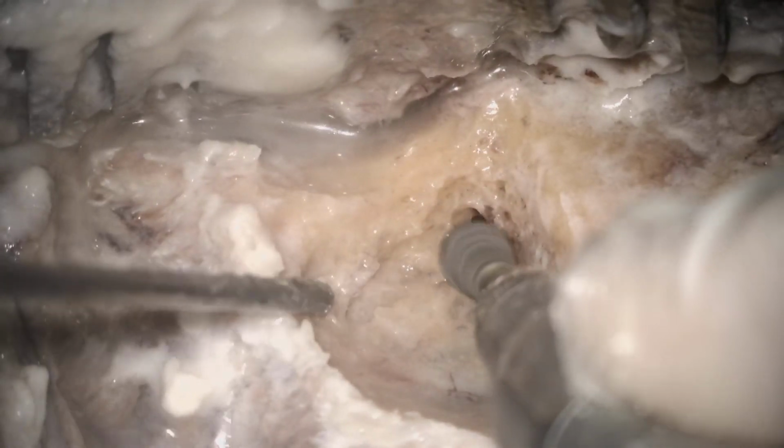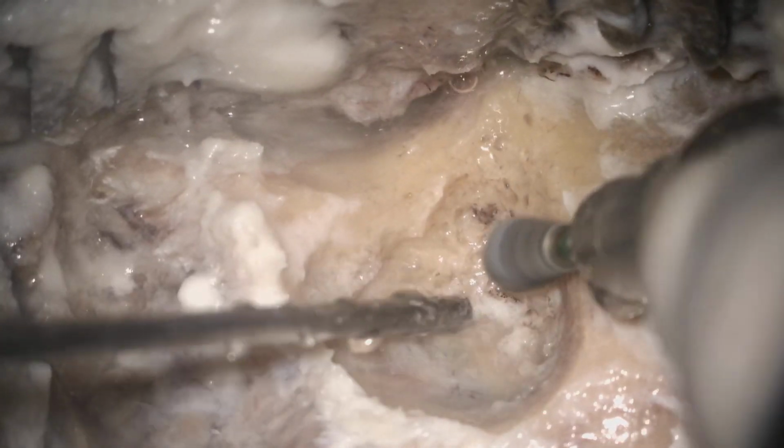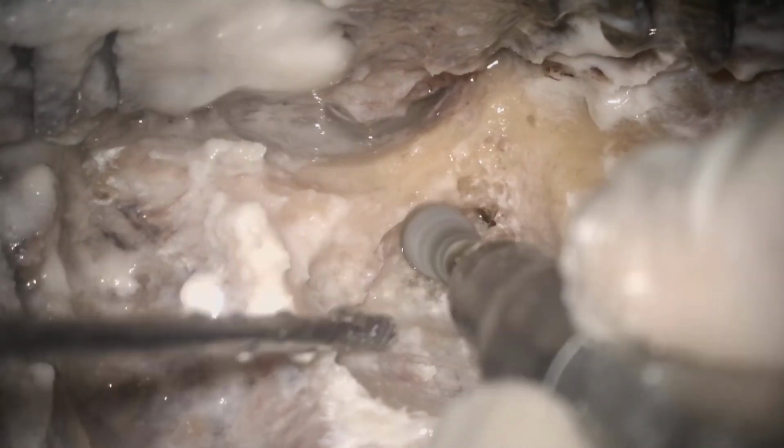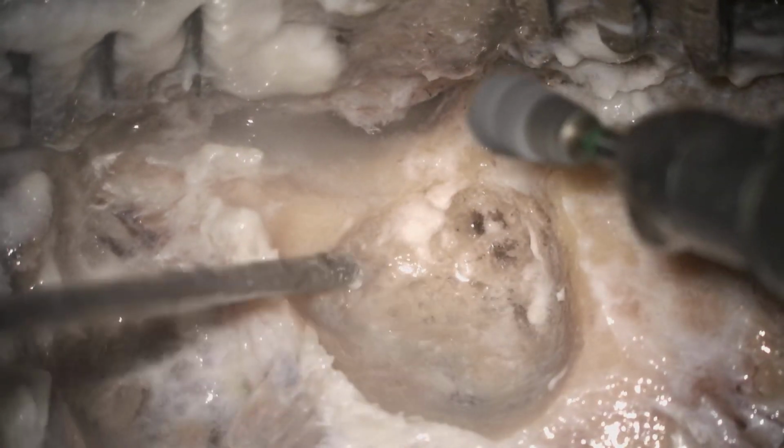So in that regard, temporal bone dissection, delineating all the anatomical structures, is definitely more difficult than a live surgery, because in live surgery there will be bleeding, there will be sentinel bleeding. You will have some clue every time you dissect the anatomical part. But in cadaver dissection, these bleedings are not present, so it will be definitely easy to dissect, but this sentinel bleeding sometimes helps the surgeon identify the critical structure that will be nearby. So we have already delineated the sigmoid sinus.